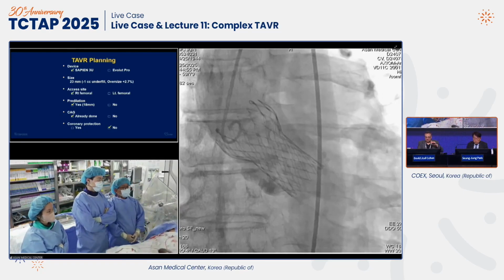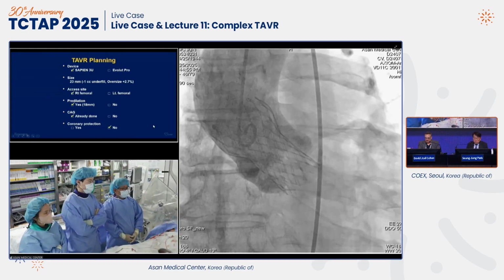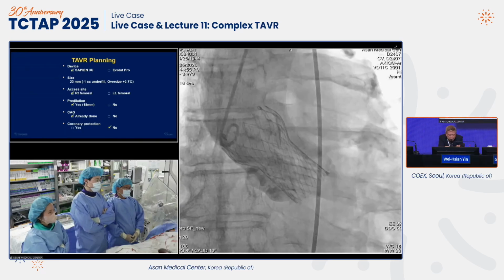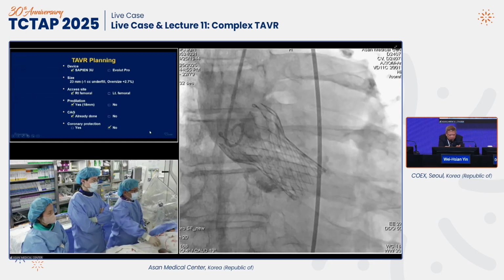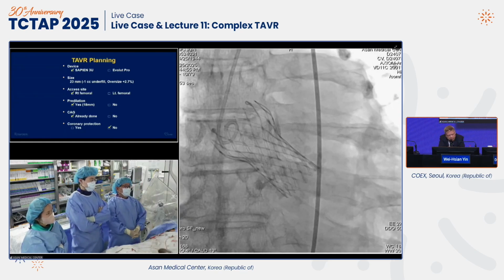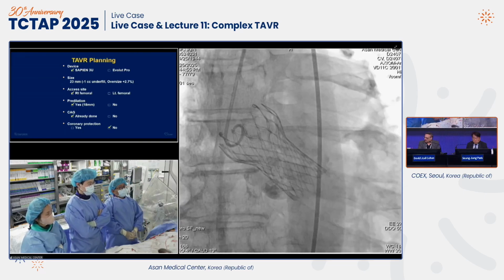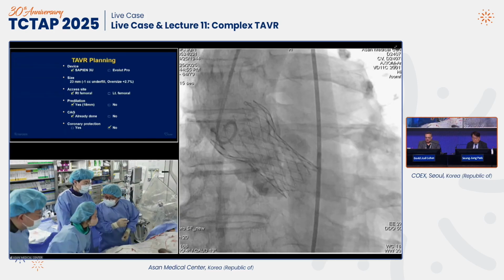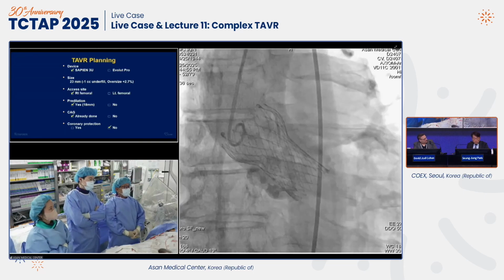Yeah, just aim the neoskirt height below the coronary takeoff. I think we don't care too much about the node, and also we don't care much about the leaflet overhang, because there has been no strong evidence showing significant hemodynamic consequences. If they go at node 6, there shouldn't be any overhang, though. Yeah, that's as high as it goes. You're right, we used to worry about overhang, but it seems like it's less of an issue. Any other pressing comments? Yes, this one?